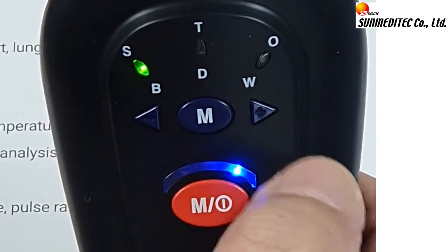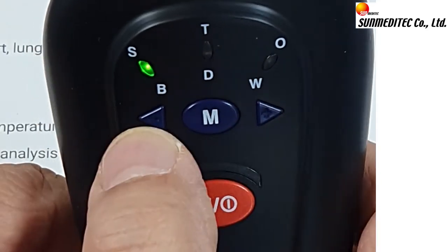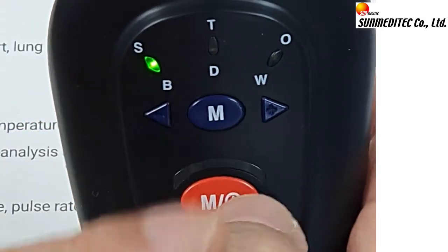Volume consists of digital levels. Plus means high and minus means low. The LED window displays the state of the mode.